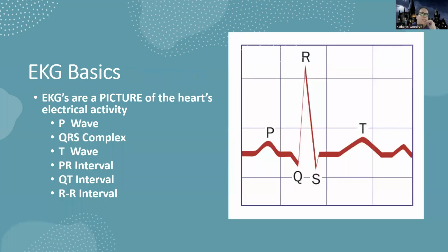All right, let's start with the basics. So first, let's talk about the different parts of the ECG or EKG. I'm going to stop saying ECG or EKG and just say EKG. Know that they're used pretty interchangeably. Usually ECG refers to when we have someone on a tele monitor, and EKG is more what we talk about when we are doing a 12 lead, but tomato, tomato, I promise there's nothing tricky on the exam, at least on my exam related to that.